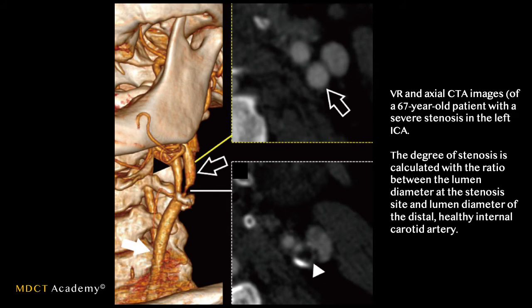Here is another case — a 67-year-old patient with severe stenosis of the left internal carotid artery. The 3D volume-rendered image is on the left, with images above and at the level of the stenosis. The axial image at the level of stenosis shows, with the white arrowhead, a very low-density plaque — almost fat-density — with an irregular wall causing stenosis. Additionally, above the stenosis, you can also see post-stenotic dilation.